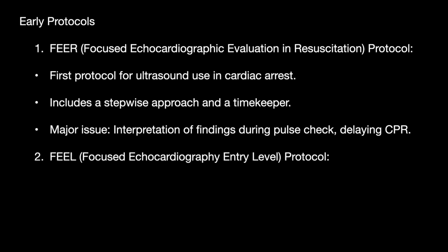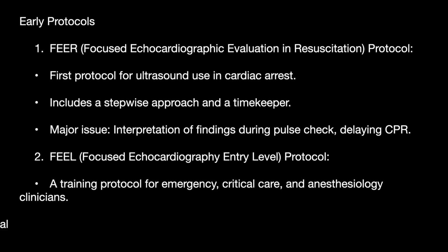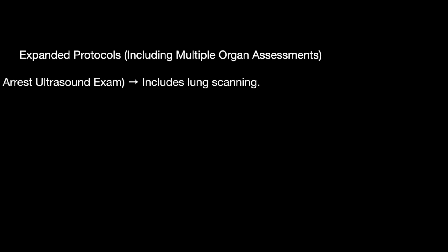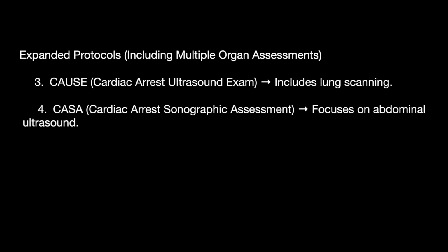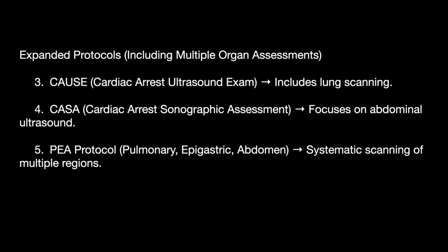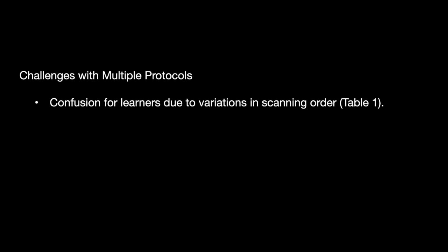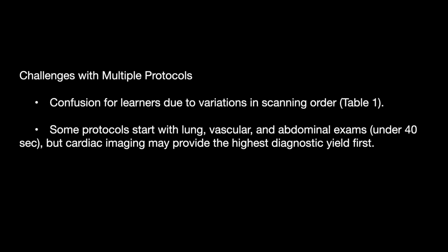The next is FEEL, that is focused echocardiography entry level protocol. It is a training protocol in emergency and critical care. The study found that POCUS changed management in 70% of the pre-hospital ACLS cases. Next, we have multiple expanded protocols, that is CAUSE, CASA, PEA protocol, SESAME. Now, they were looking at various aspects. The challenge with these multiple protocols is that it creates confusion. We will show you the table.